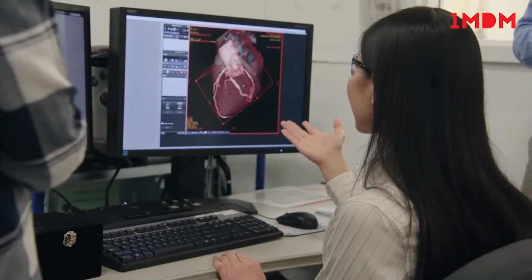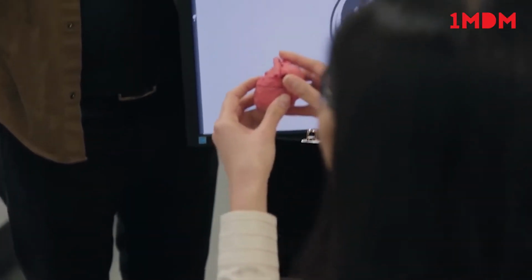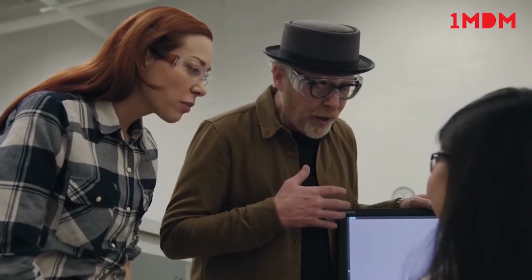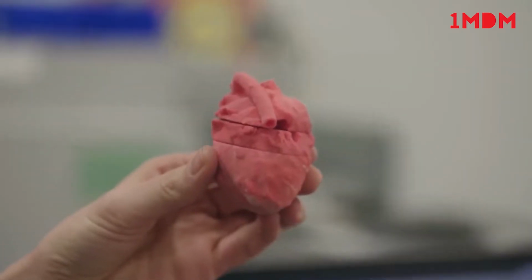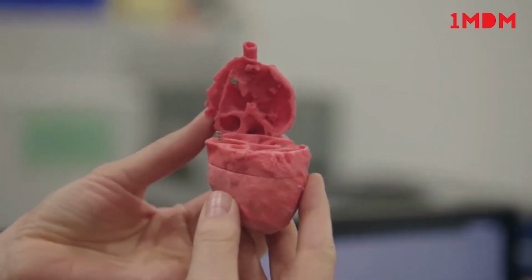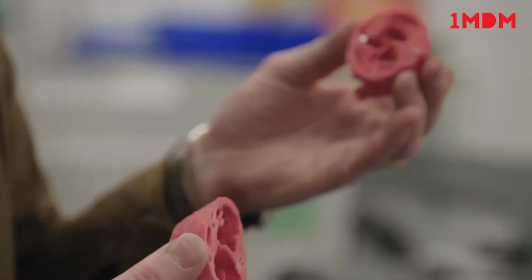And the best part is not only can you see the 3D image graphically, but here we actually have a 3D printed heart from the CT images. So this is actually the heart of a 4-month-old, and you'll see it's in layers, so you can kind of peel back. You are kidding me. So it's not only getting the surface topography, but also internally the structure of the heart? Correct. That's incredible. This is mind-blowing. It's heart-blowing. Before this technology was available, if your child was going for surgery, the first time your doctor might see your child's heart would be when they're inside surgery. Now you don't need to do that. Also for implants, you could be scanning and printing pieces custom built for our bodies. Exactly. Like, clearly this kid's eating too much junk food though.